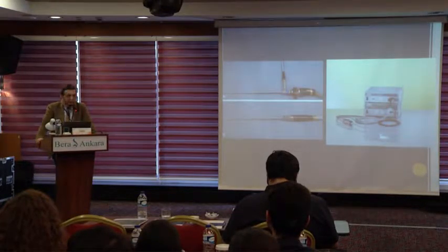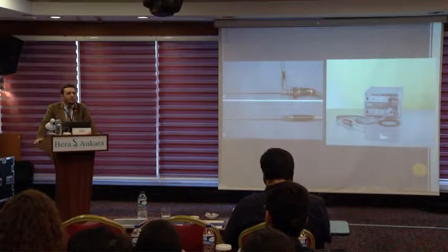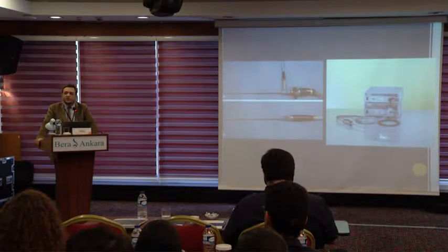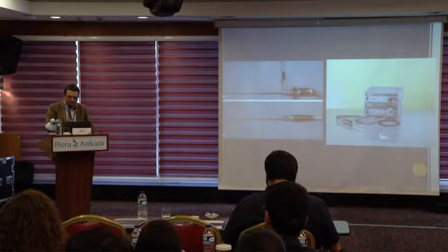We usually use a 0-degree lens system, but we are very familiar with the 30-degree lens too, because of the other basic urologic procedures like cystoscopy and transurethral resection of prostate and bladder tumor.